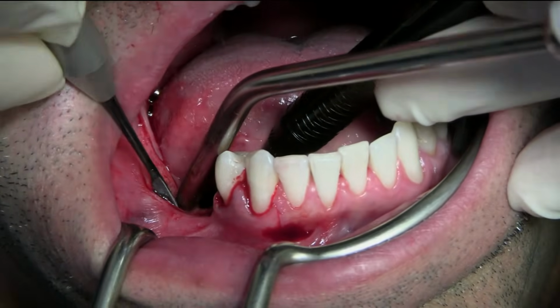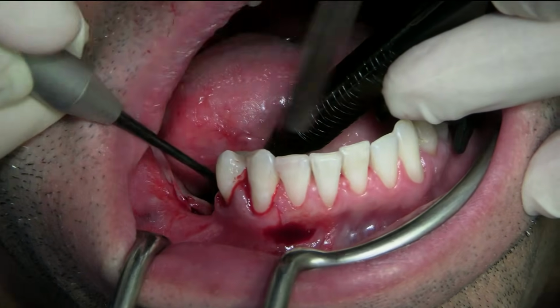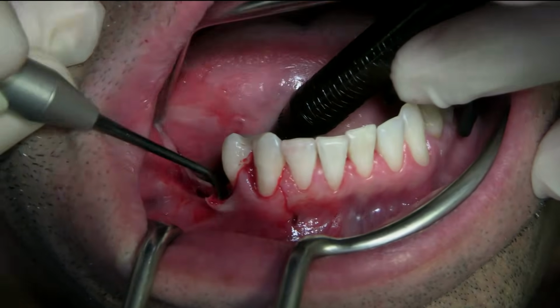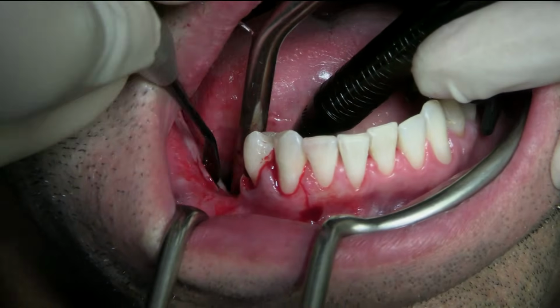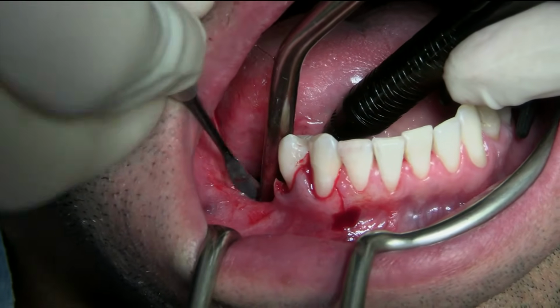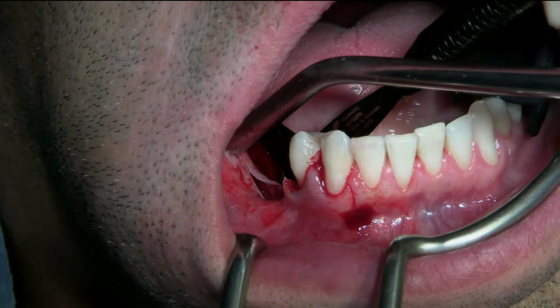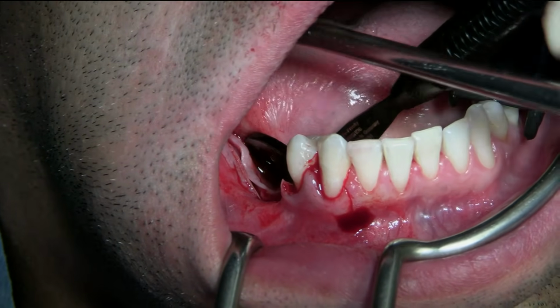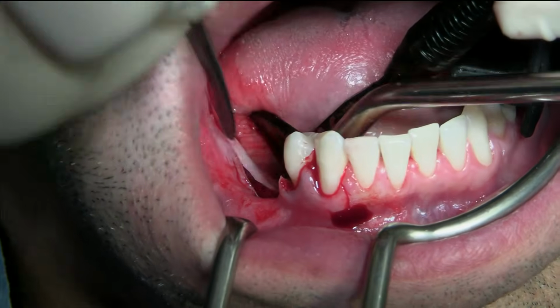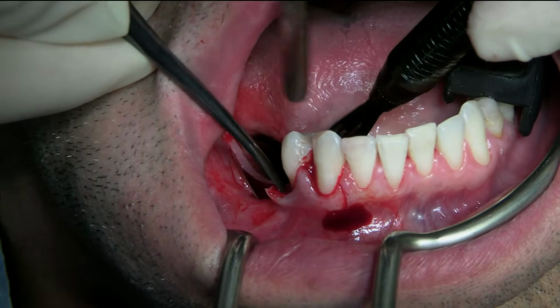It's a little bit difficult to see where I am because the dip is going so far apical, and I don't want to have any risk for soft tissue perforation. Let me have a Prichard. Once we get the soft tissue elevated correctly, we'll be in a better position.